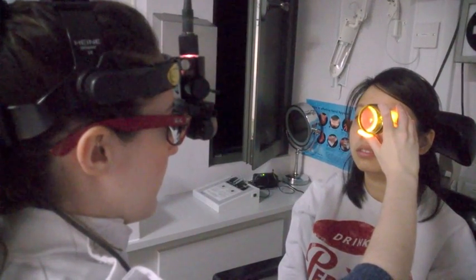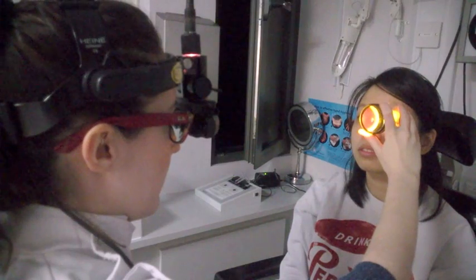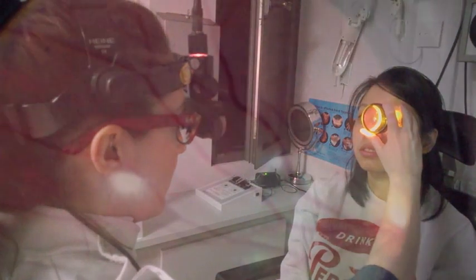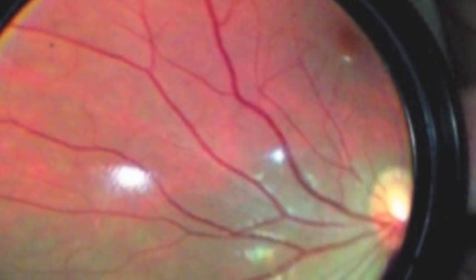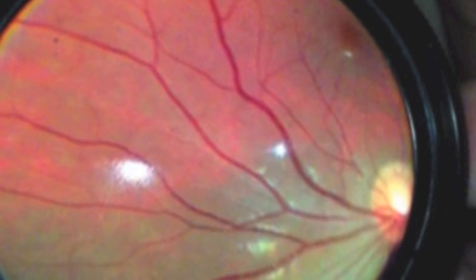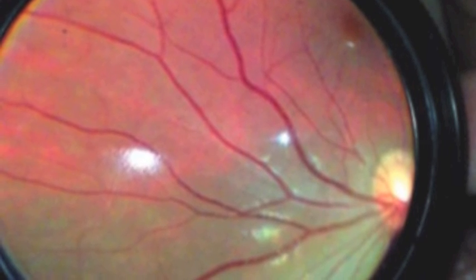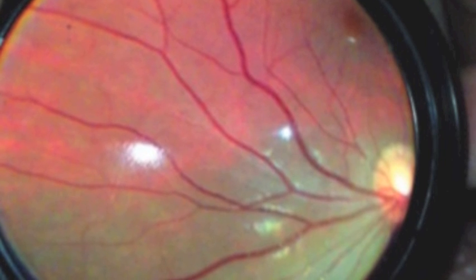You should first see a magnified erect image of the front of the eye. You can then slowly pull back the lens until you see an image of the fundus that fills the lens. After some practice, you should ideally start by looking at the periphery and save the posterior pole until the end of the examination to avoid patient discomfort.